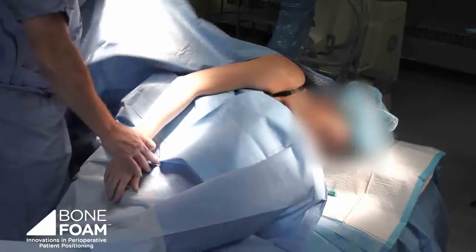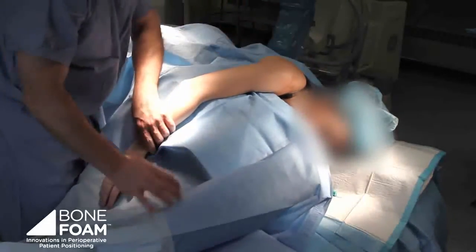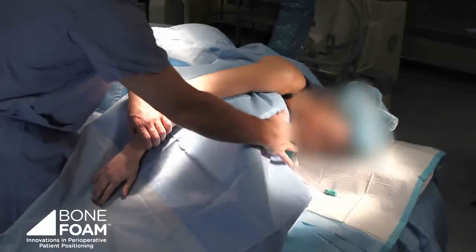I'm just showing a U-drape here. You could use an extremity drape as well. This is what the working surface would look like with the patient draped.